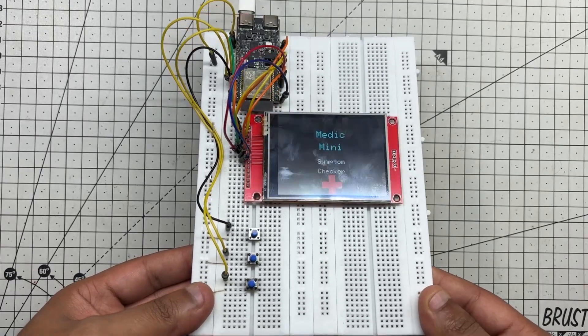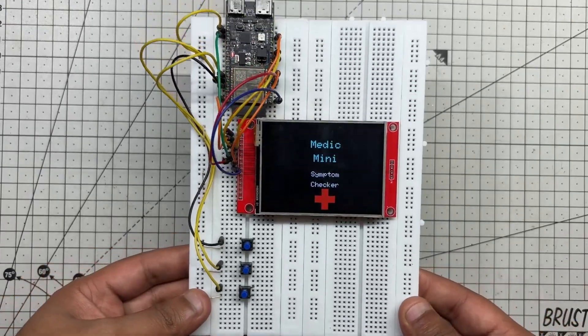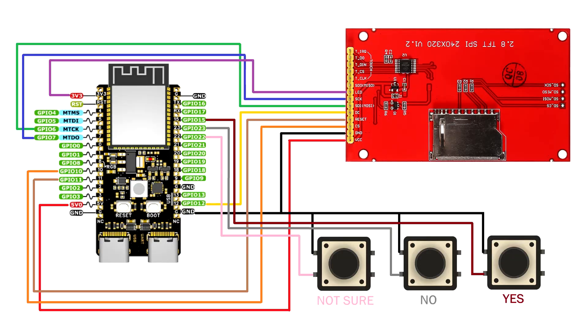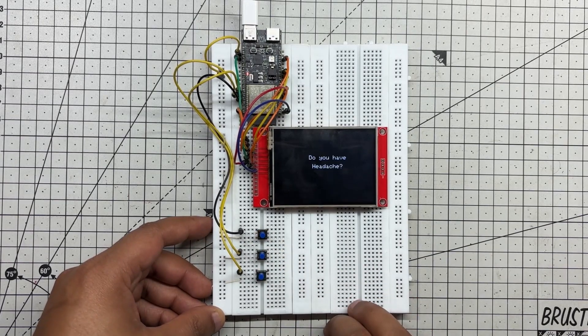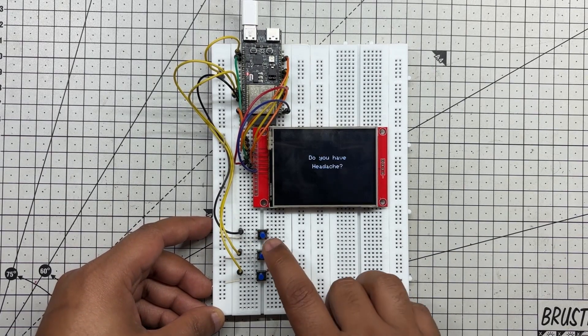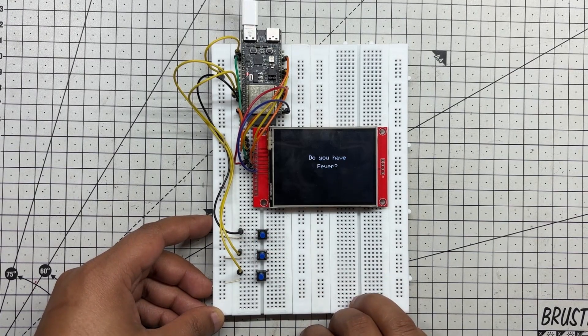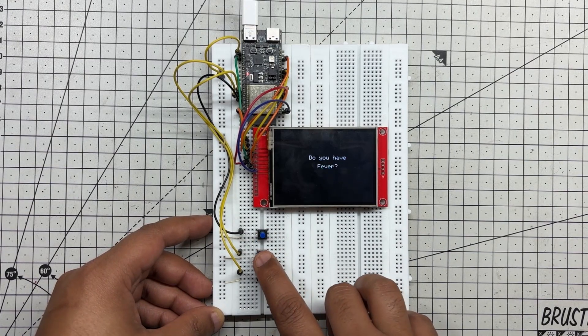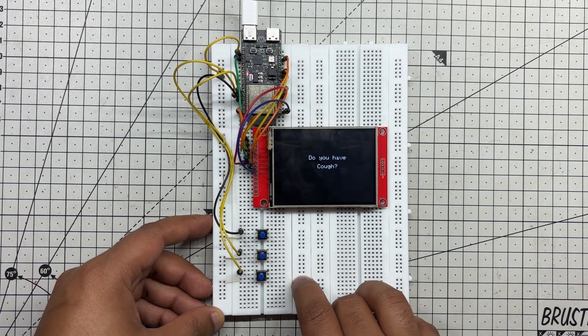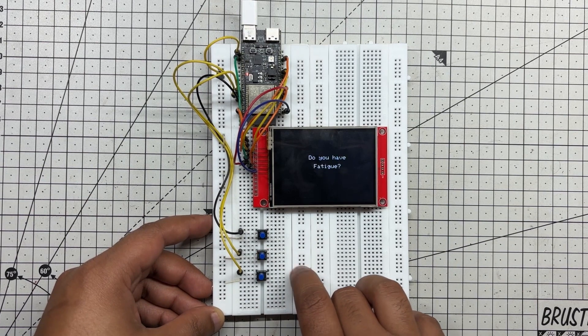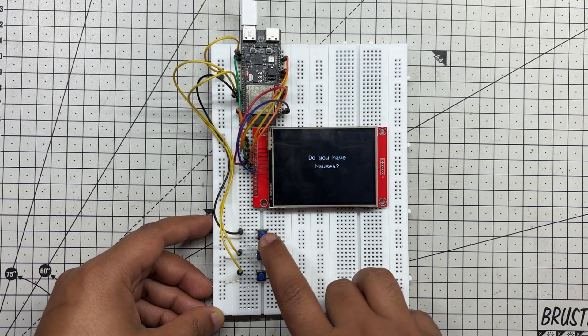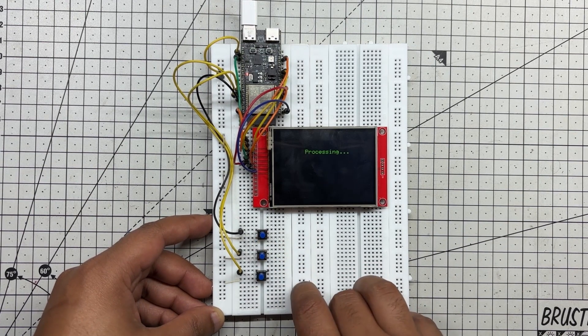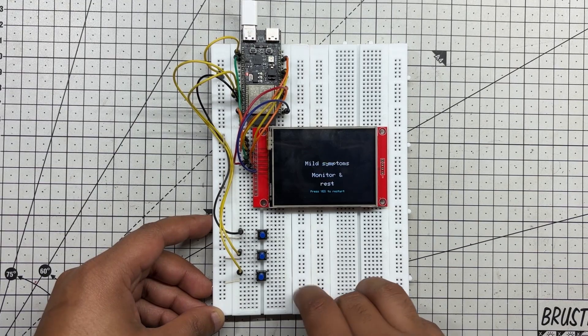To get started with the first iteration of this project, I first built a simple breadboard setup that uses the ESP32-C6 dev kit connected to an ILI9341 display. For user interaction, I added three tactile buttons—yes, no, and not sure—mapped to GPIO pins. This setup serves as our base model for testing the core logic and UI flow.